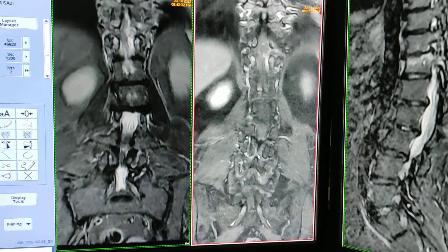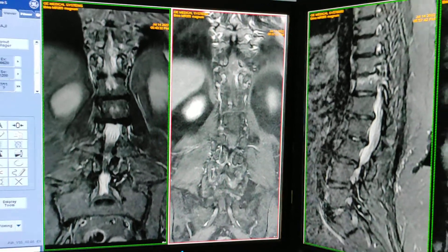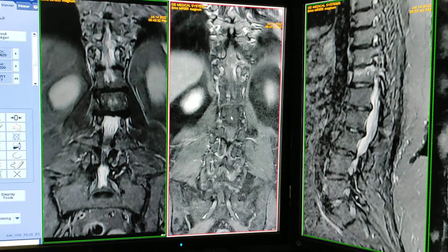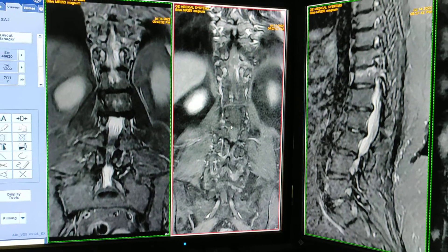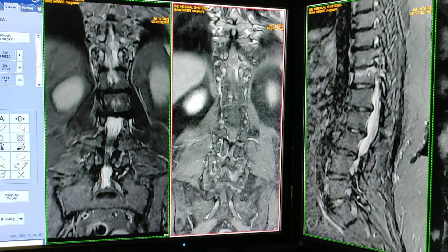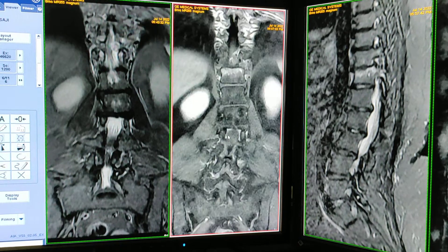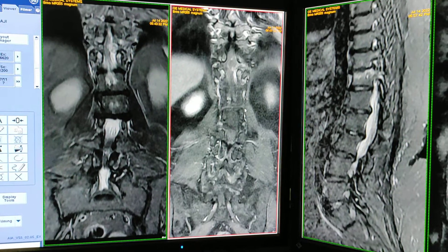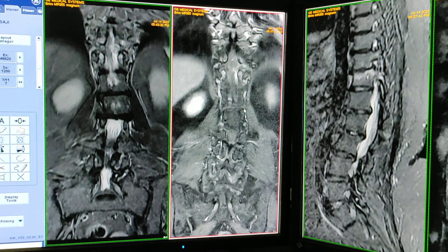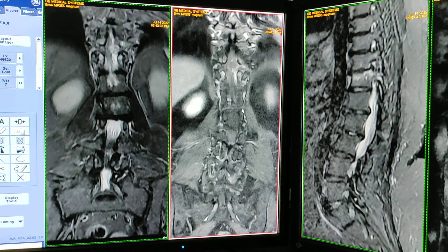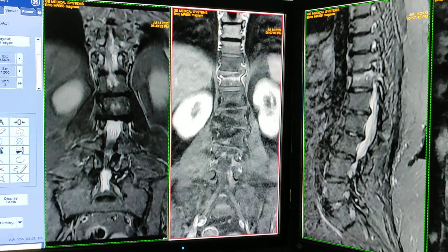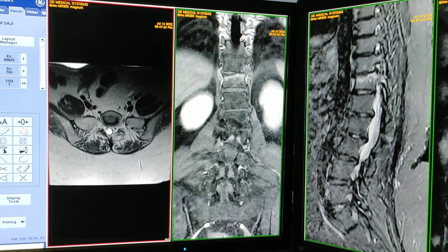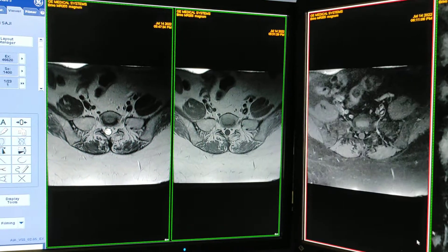Post-contrast or fat-sat T1 sequence — this is the lesion. You should always compare with and without contrast. Contrast is necessary because the enhancement pattern after contrast tells you how much enhancement there is. I will now show you XL T2, XL T1, and XL post-contrast.